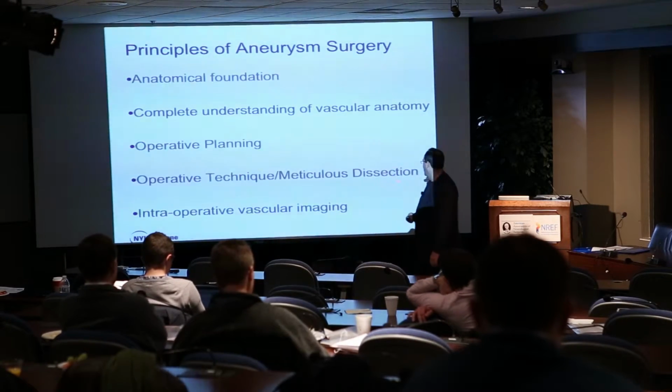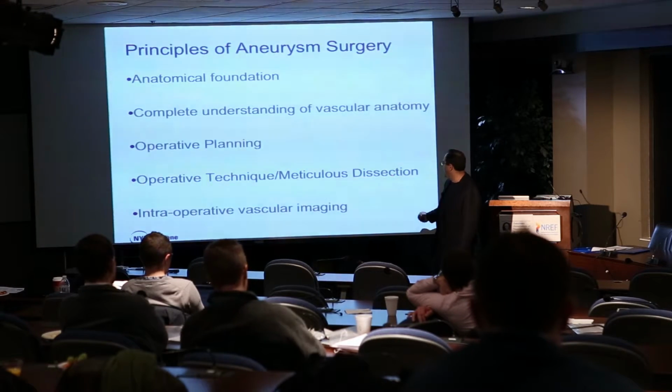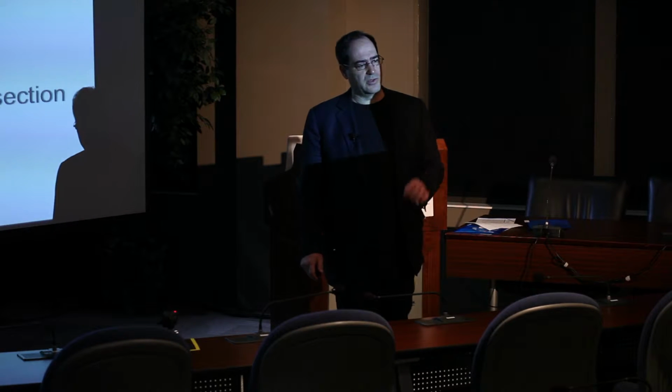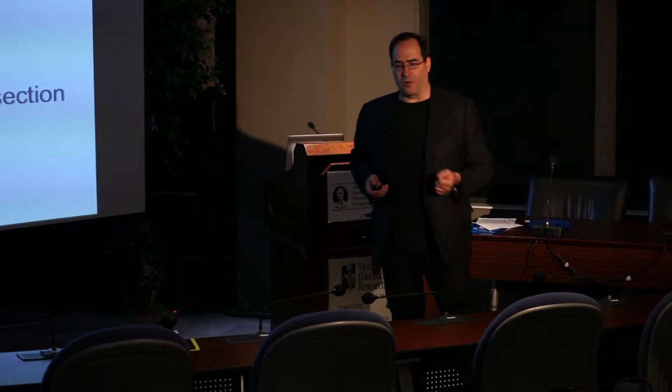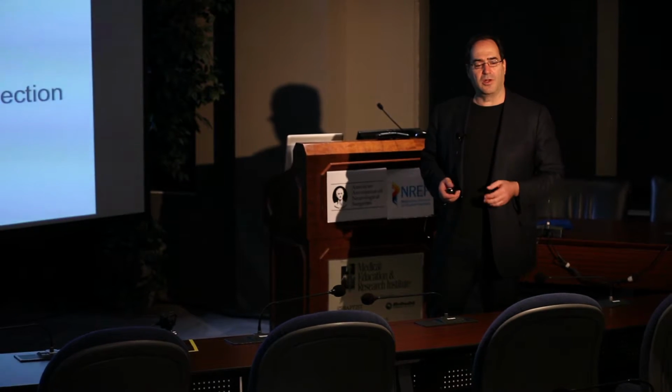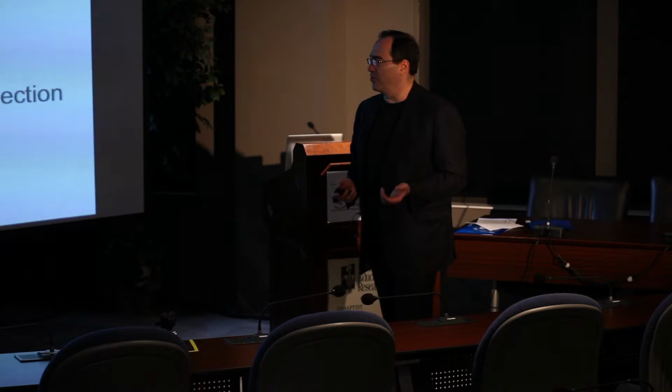And your technique, I learned this when I did my fellowship out in Phoenix with Dr. Spetzler: meticulous dissection. Take your time, expose everything. When you get the experience of a Dr. Harbaugh doing a particular type of operation, then you can ramp up the speed. But in the beginning, when you're learning how to do stuff, take your time.